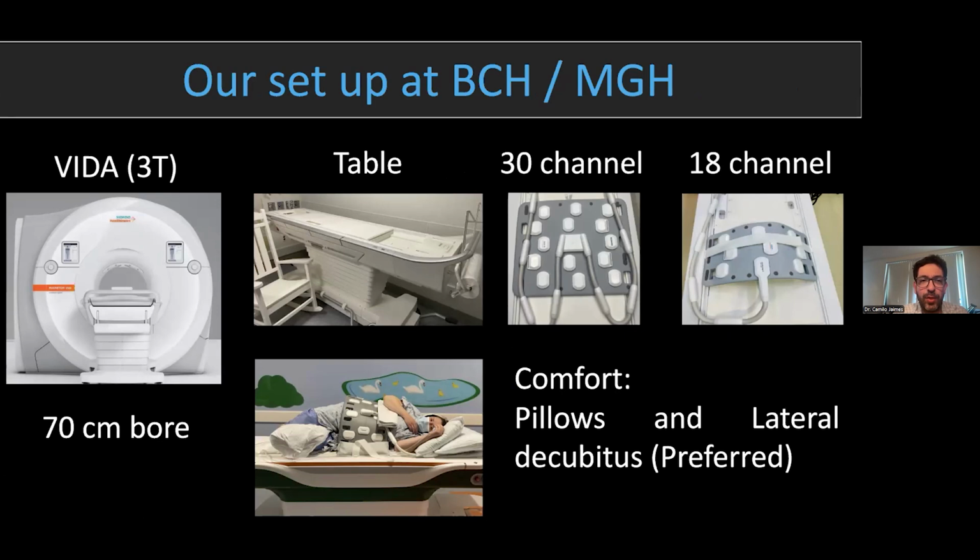The first thing that we do is we tend to rely on 3T imaging. 3T imaging is great, but the second thing that comes right next to 3T imaging is maternal comfort. So amongst the 3T systems, I would definitely encourage people to use scanners that have a larger bore. The 70 centimeter bore scanners, I think, perform much better. So if you have a Vida or a Skyra, I tend to favor those over a Prisma. Prismas are great and have great gradient performance, but you won't need that. However, those extra 10 centimeters in radius matter a lot, particularly for a pregnant woman.